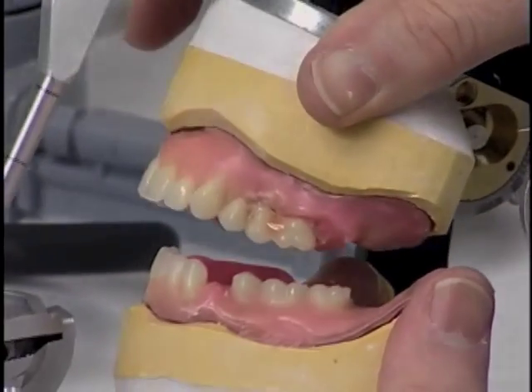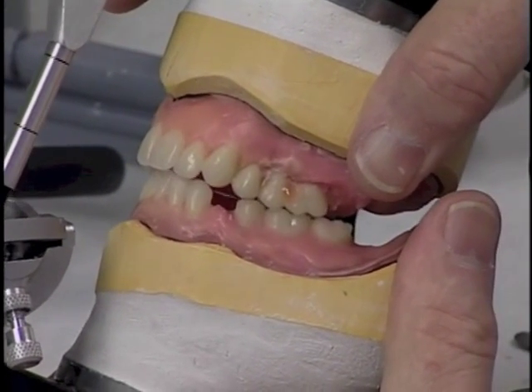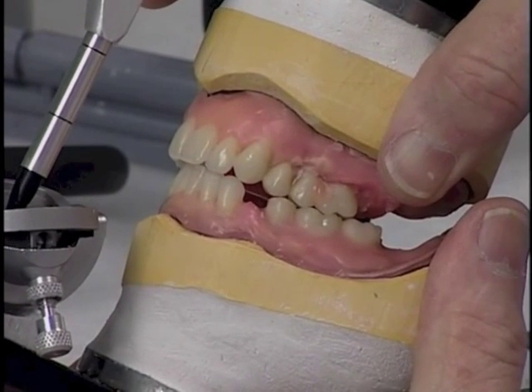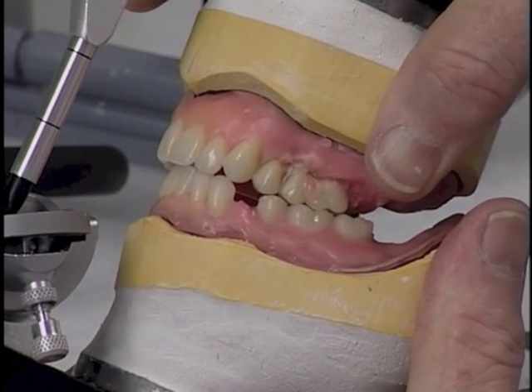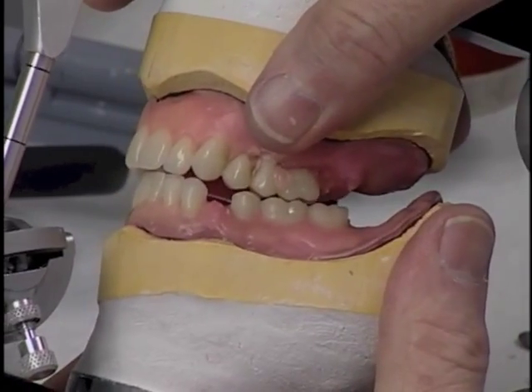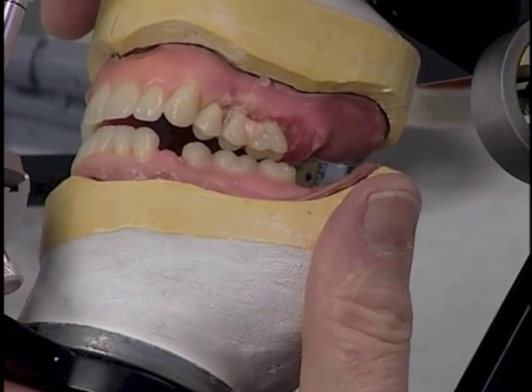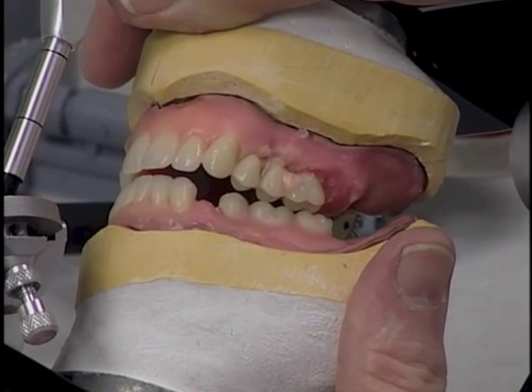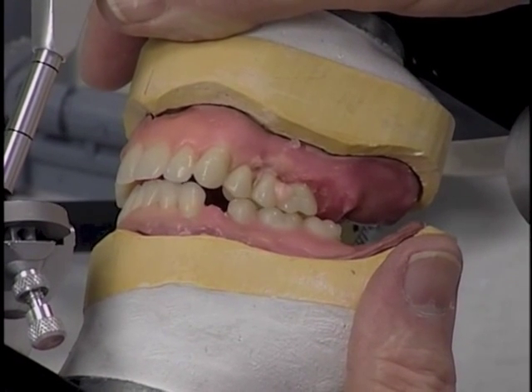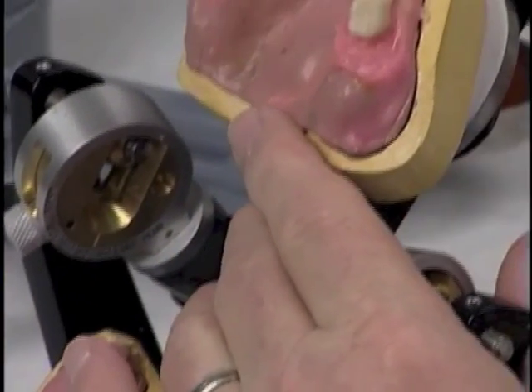If we close this into centric relation, that's looking pretty good now. As we can see, we have good cusp-fossa relationships of virtually every tooth in working relation and in balancing relation. That's first molar. I like where that position is at.